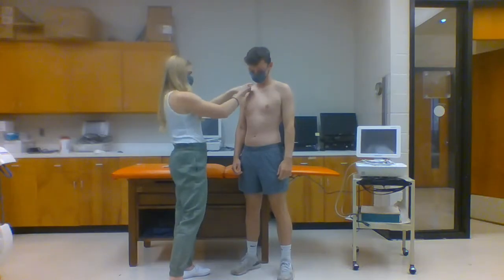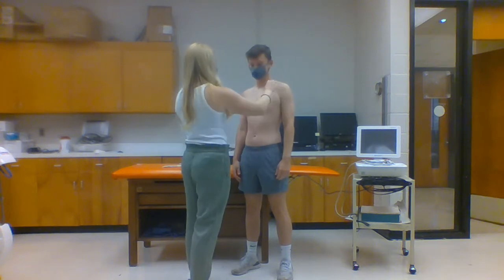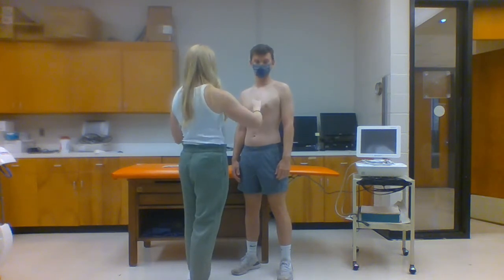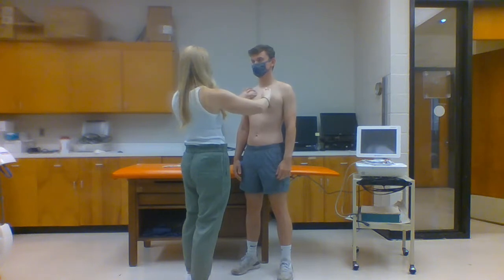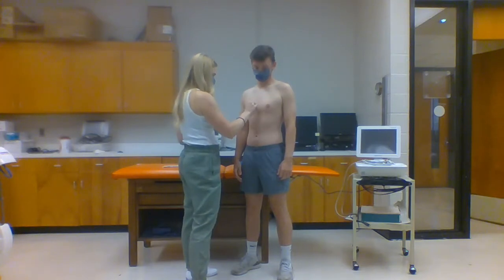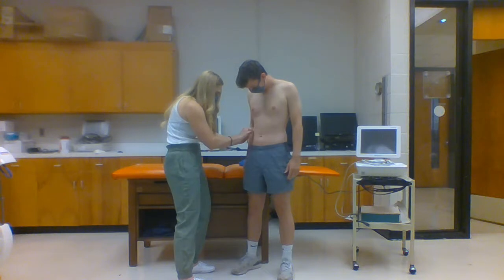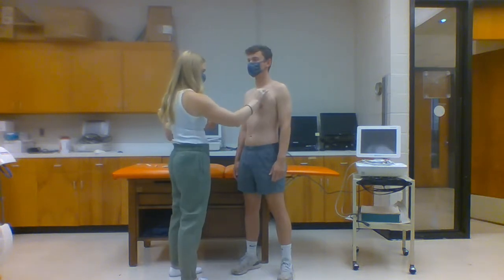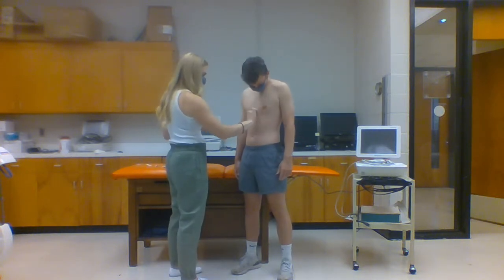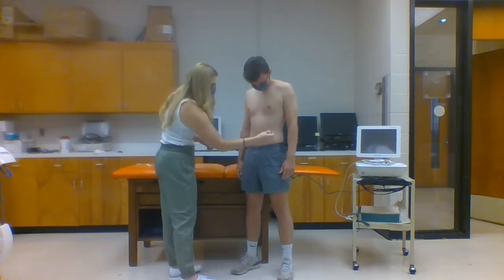Skin preparation. Before you place the electrodes on the skin surface, you want to make sure that you have a very clean surface area. Start by removing any hair by shaving the part of the chest where the electrodes will be placed. Next, remove any dirt or dead skin with a small abrasion pad or sandpaper. Lastly, clean the site with a small alcohol pad. This may sting a little, but we want to make sure that we are removing any excess from the skin.